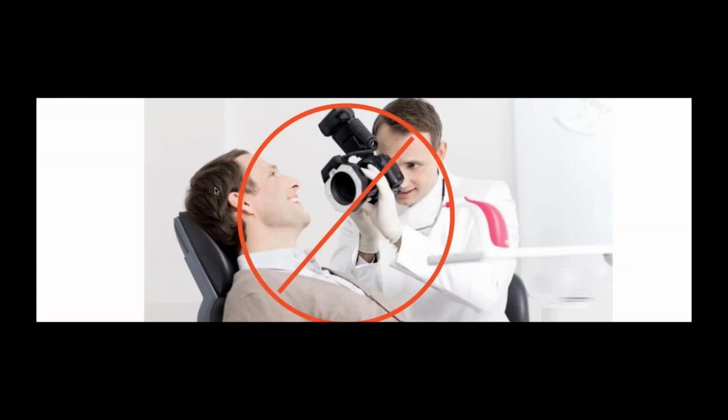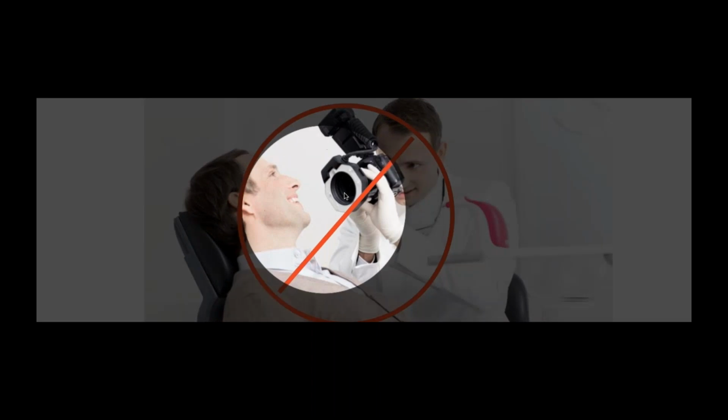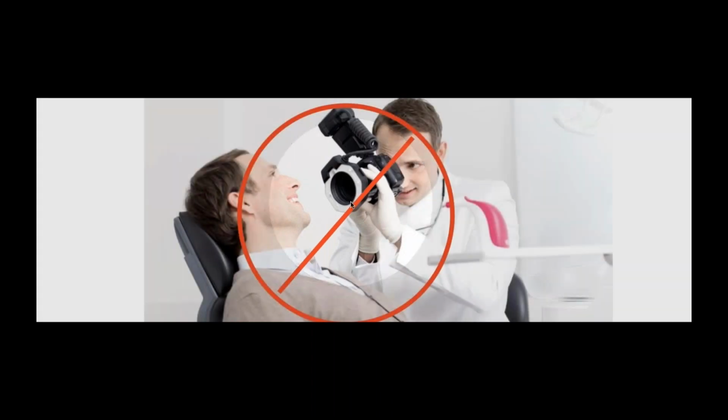One of the mistakes I see in a lot of clinicians today are 2 main ones. One, the dreaded ring flash. Using flashes that are close to the lens is a no-no for shade taking. And the second one is photographing your patient while he or she is still in some sort of a dental chair. Whether they're sitting up or leaning back, it doesn't matter to me. I don't want them in a dental chair.